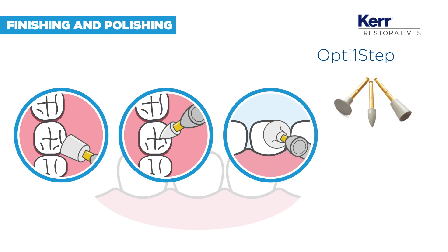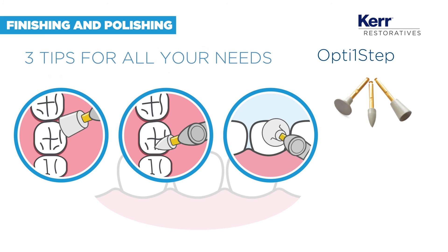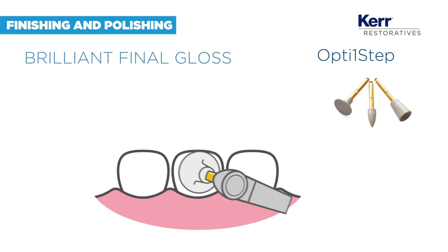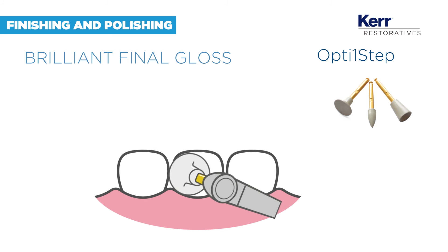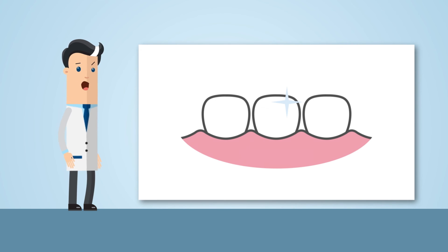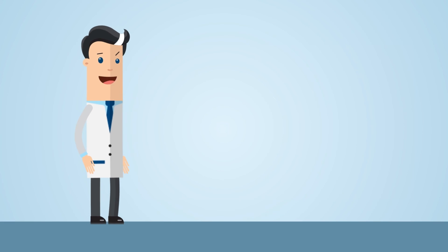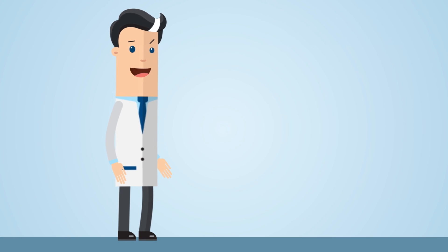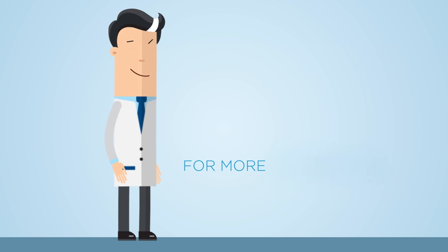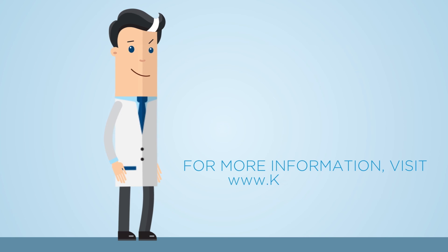Now you just have to choose the right Opti1Step tip to give your restoration the final gloss it needs. And just like that, you are done — a beautiful and natural restoration, and a sure way to keep your patient satisfied. Discover more about our products and the technology behind them on kerrdental.com, and stay tuned for our next dental procedure.